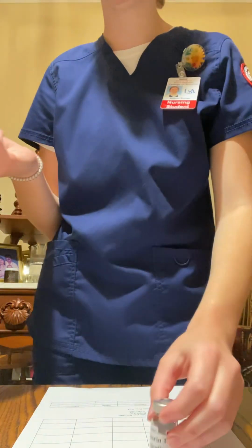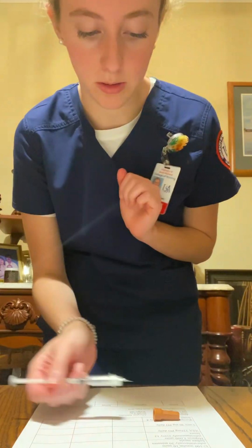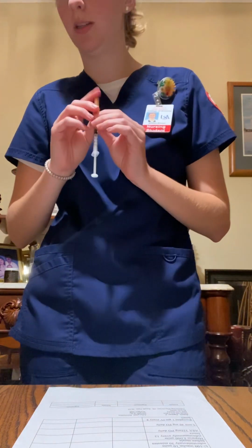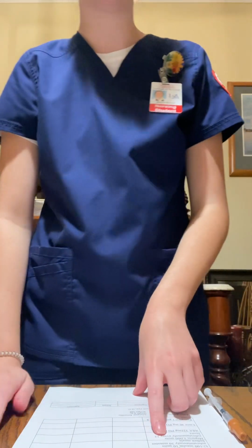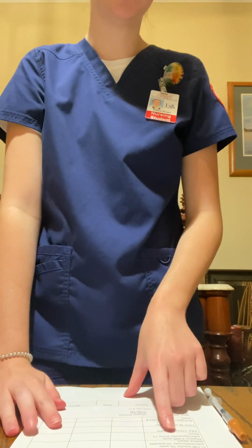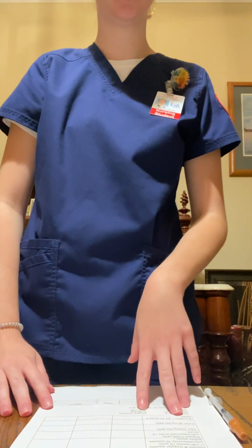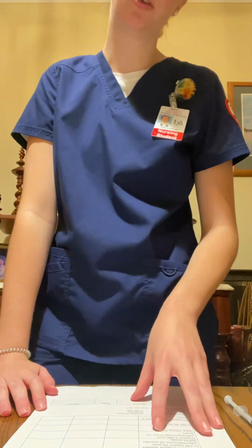And since this is a heparin shot, I would verify it with another nurse. So I'm going to use the scoop method and pick that needle up and recap it. And then I'm going to continue with my first check. So for the time of it, it is every 12 hours, and my patient hasn't had it within the last 12 hours. So we're good to go with that. And then the indication again is for blood clots, since it's an anticoagulant.